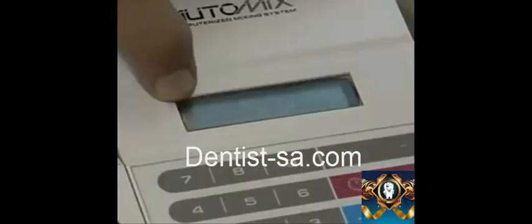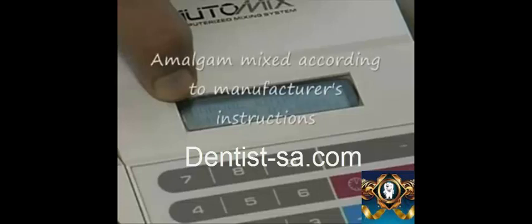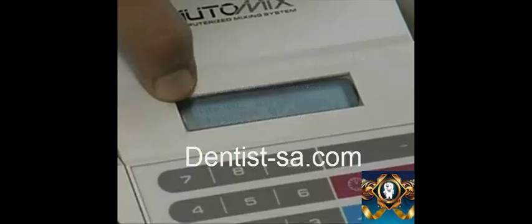Amalgam must be mixed according to the manufacturer's instructions. For the Valiant PhD amalgam that we use, the trituration speed should be 4200 CPM with time set at 7.0 seconds for a 1 spill amalgam cartridge and 9.0 seconds for a 2 spill cartridge, which has twice as much amalgam.